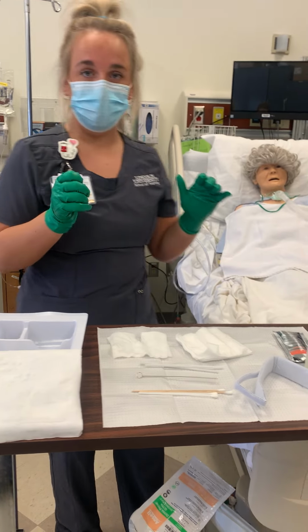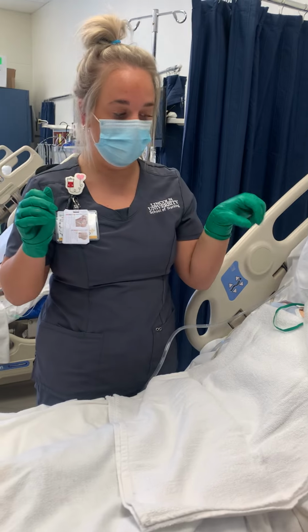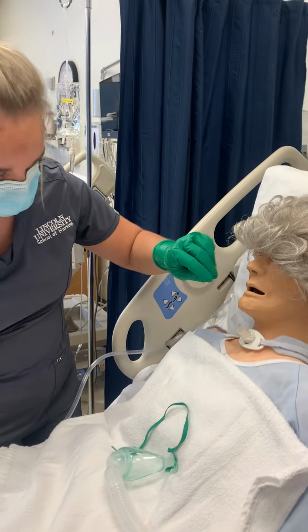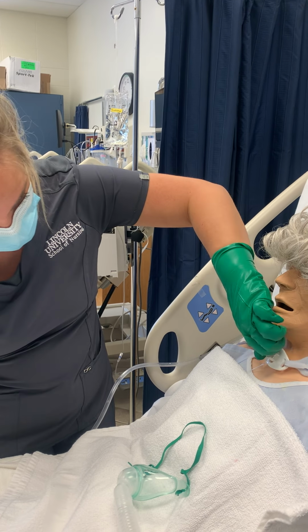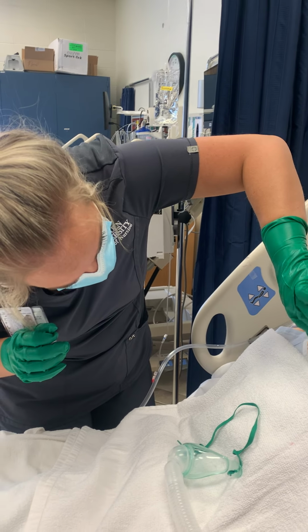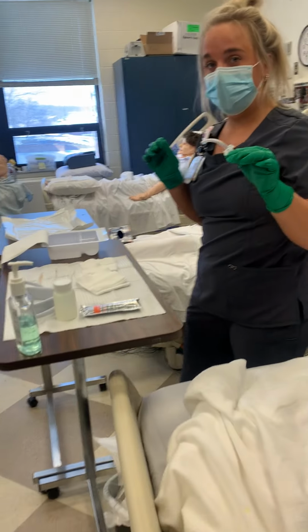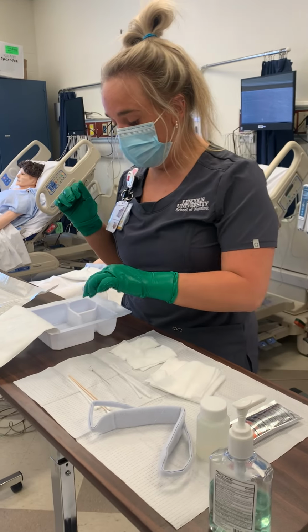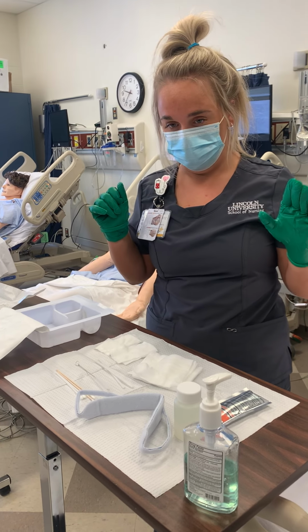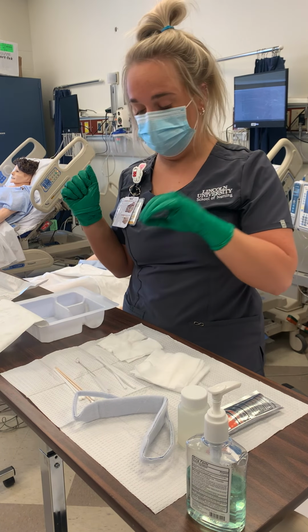Okay, so I'm going to come over to my patient. I'm going to break sterility with my non-dominant hand, remove her oxygen, and take out the old trach. All right, Mrs. Smith, we're just going to go ahead and take this out, okay? Making sure to grab a hold of it. I'm going to put it into that compartment with the hydrogen peroxide in it, giving it a second to sit there and clean. I'm going to take it out again with my non-dominant hand.